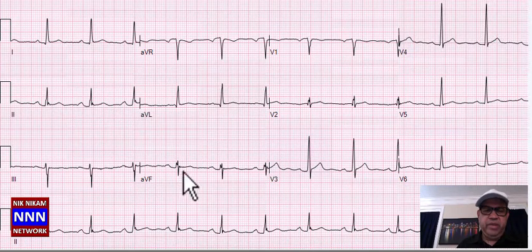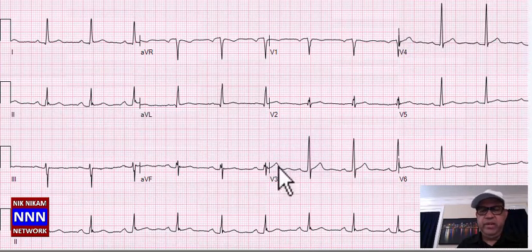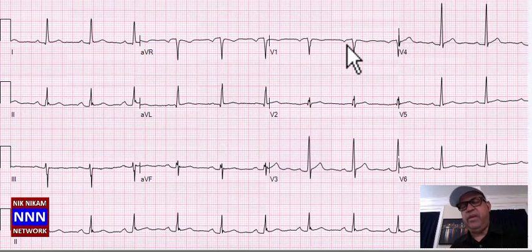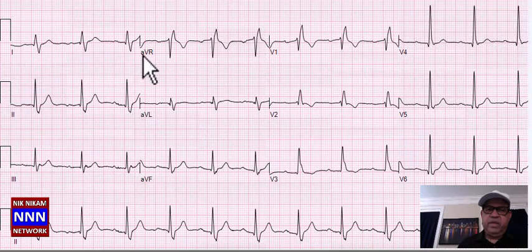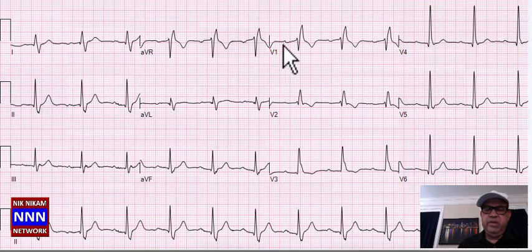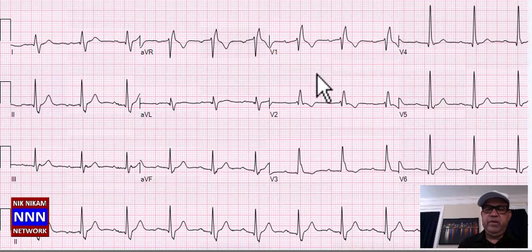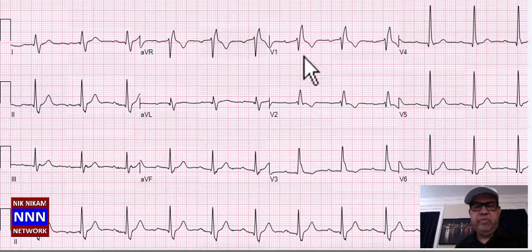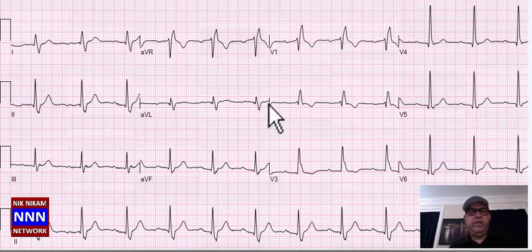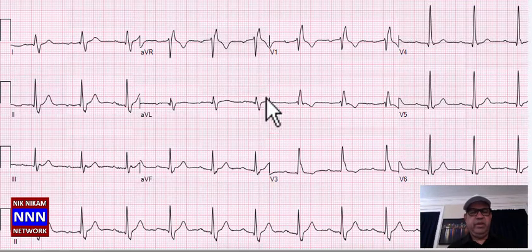Sinus rhythm, T-wave changes in the inferior leads, not enough criteria for left atrial enlargement. Sinus rhythm with complete right bundle branch block and no other findings of great significance.